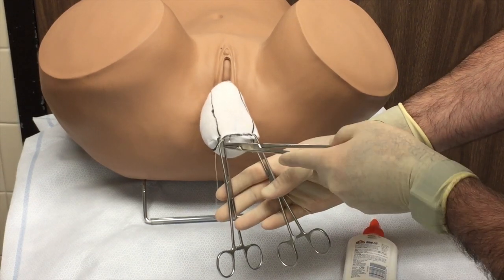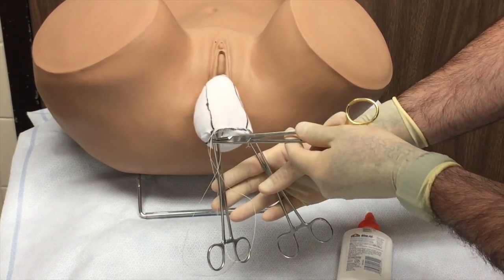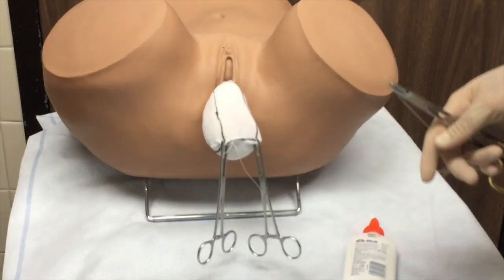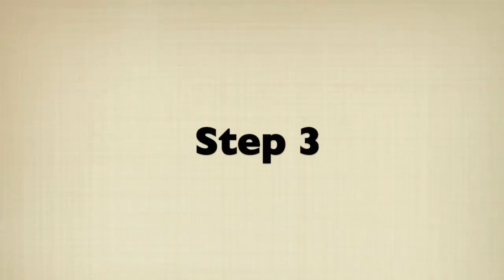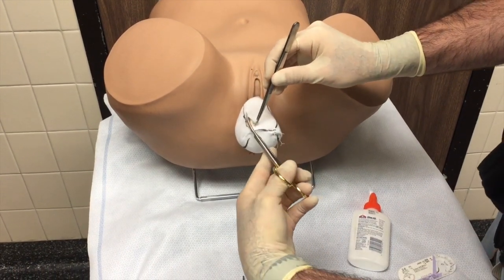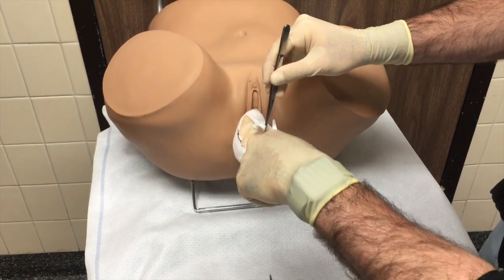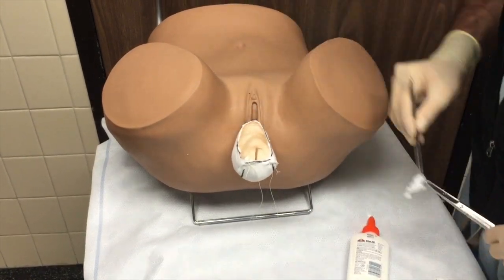We now place figure-of-eight sutures at the corners of the apex, which will serve as the margins for an epithelial island that we will create for orientation. We then denude the vaginal epithelium from its fibromuscular connective tissue circumferentially, starting with rectangles anteriorly and posteriorly to the level of the hymenal ring, leaving the island behind.